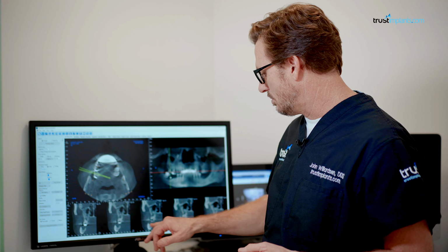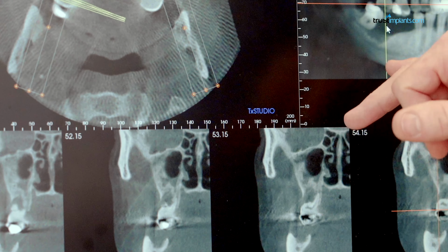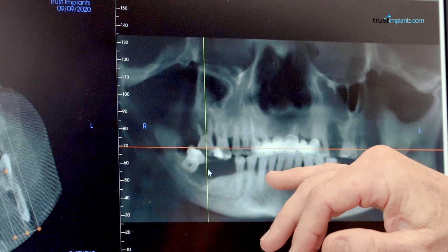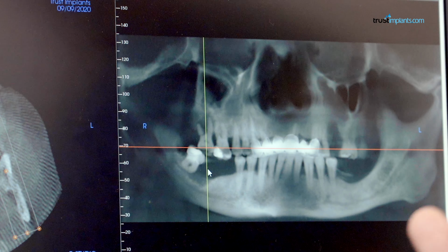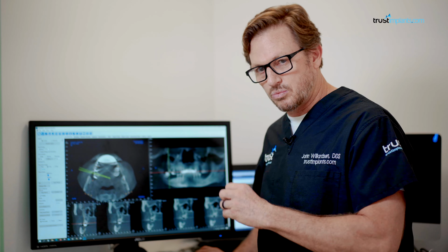Or when I pull this molar on the lower out, when I clean out that defect and all the soft tissue that's going to be inside this hole in the bone, once I clean that out and I'm down to good bone and I graft that, it's going to regenerate. And so what we do here is we plan the case out and get everything ready so that on the day of surgery we're able to go in and extract the teeth and have a set of teeth ready.